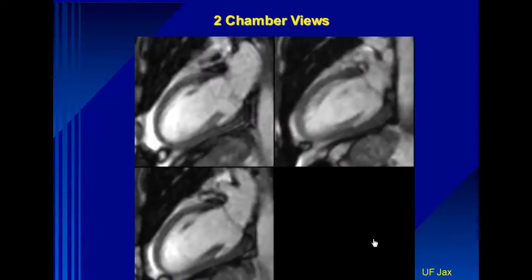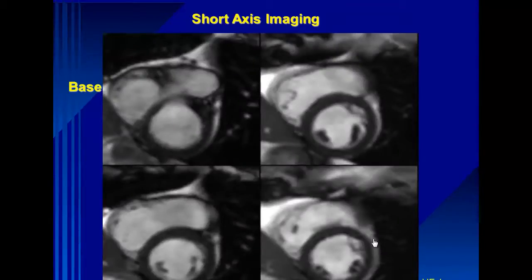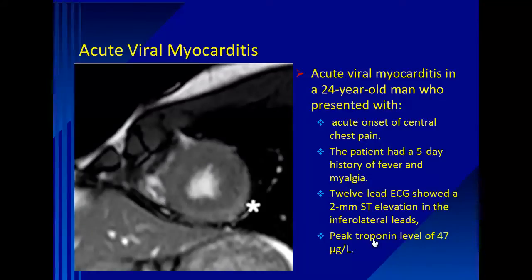Well, these movies were supposed to be movies, not just single pictures, and I apologize for that. But what you see in these images, and basically you'll say, why the heck did he put three pictures of the same thing on the slide? Actually, they're not the same. We've sliced the ventricle 3 times, and you can see the thickness of the papillary muscles is a little bit different. Here, it's kind of long. Beautiful image of the mitral valve. Well, so that was supposed to show structure.